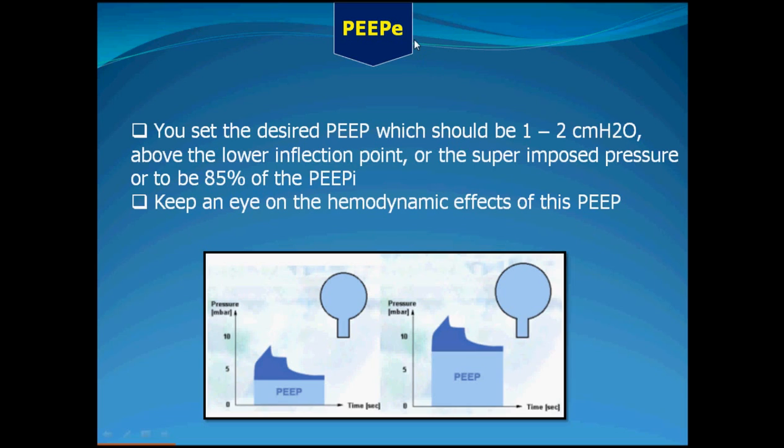Today I'm going to talk about PEEP, whether extrinsic PEEP or intrinsic PEEP. When we talk about PEEP, usually we say this is positive end expiratory pressure. We set it, and we set it for three important reasons.